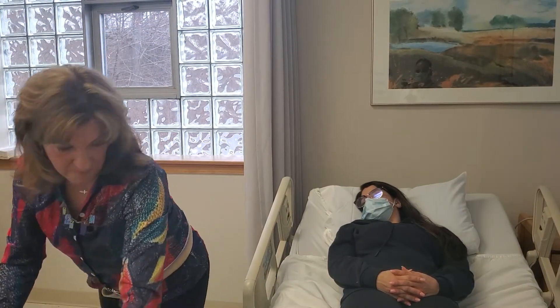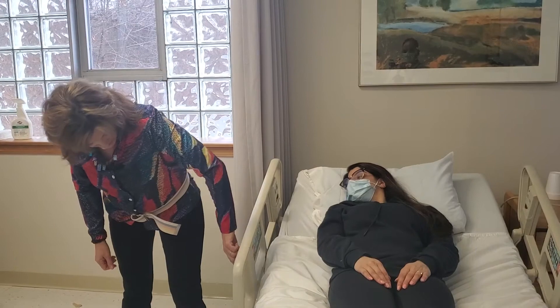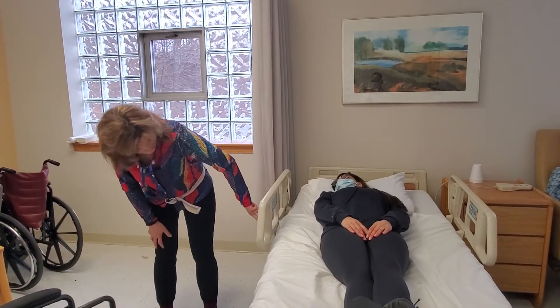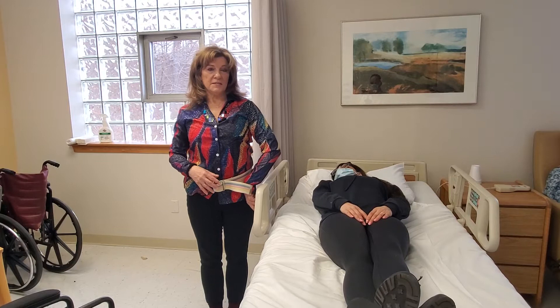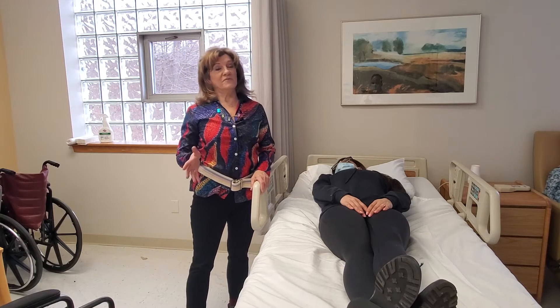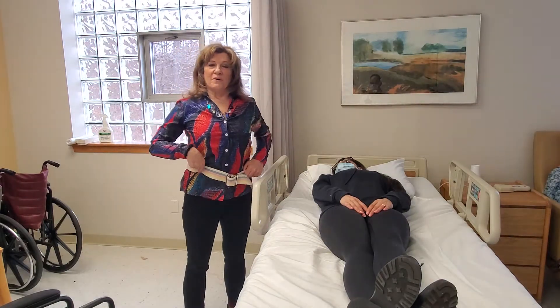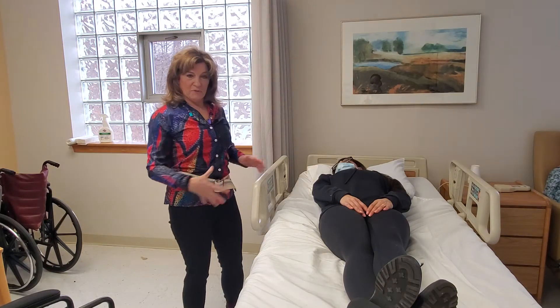We'll position the chair and then put the bed up to my level — but first flatten the bed, then use the button to bring the bed all the way up, because you don't want to hurt yourself. As a caregiver, once you put your back out, you're out of commission, so you really want to take care of yourself. Stretch every morning — I have a video on stretching, check it out so you're nice and pliable and ready to go for the day. I also have a grab belt on my waist that I'm going to be using on Cassandra to help me get her in the chair.